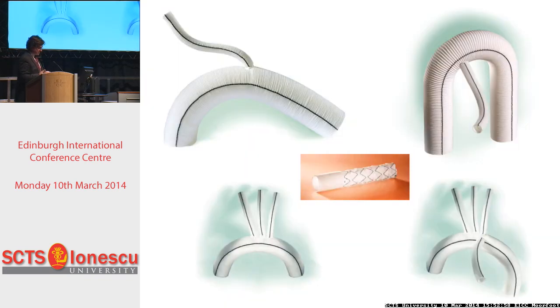And nowadays the whole thing has become very versatile. We have short grafts, long and curved grafts, 3 sidearms, 4 sidearms, frozen elephant trunks, and that really gives a lot of variability and flexibility. You can be really very creative.